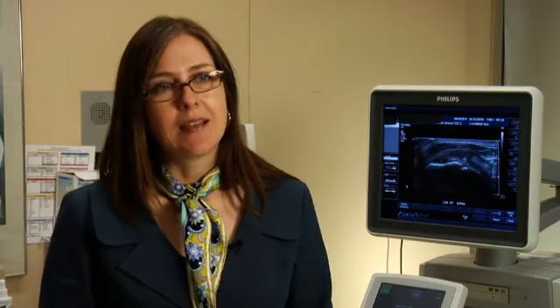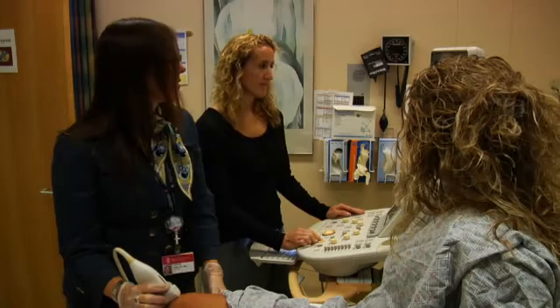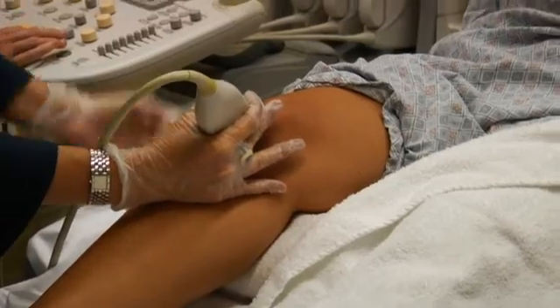Another great thing about ultrasound is that you can do dynamic imaging. You can image exactly where the patient hurts, bring them through the range of motion that recreates the pain, and provide therapy on the spot — for example, inject medication into a tendon sheath or bursa where you find the problem and provide immediate relief. So ultrasound can directly guide the intervention, and the patient walks away extremely happy.